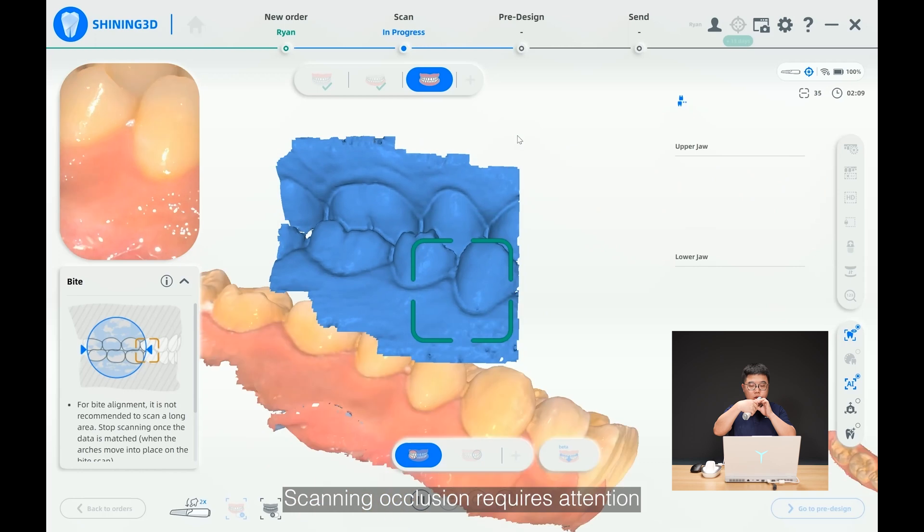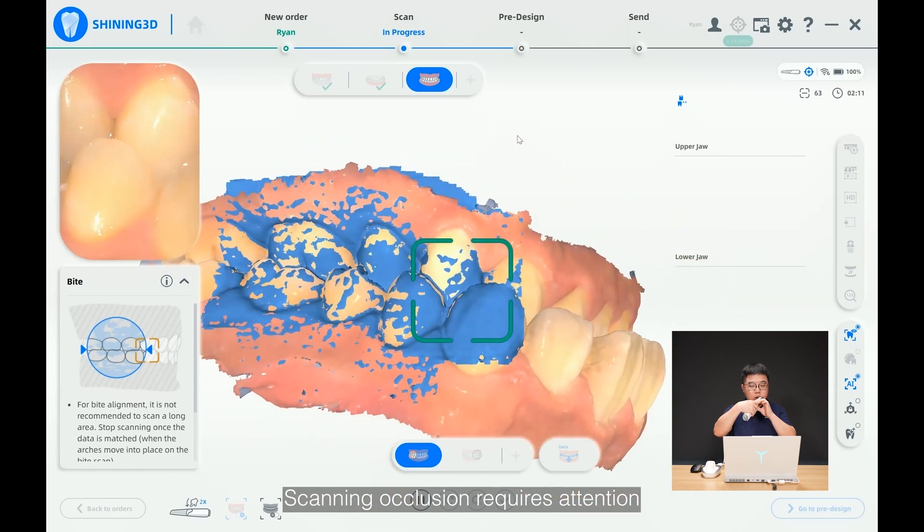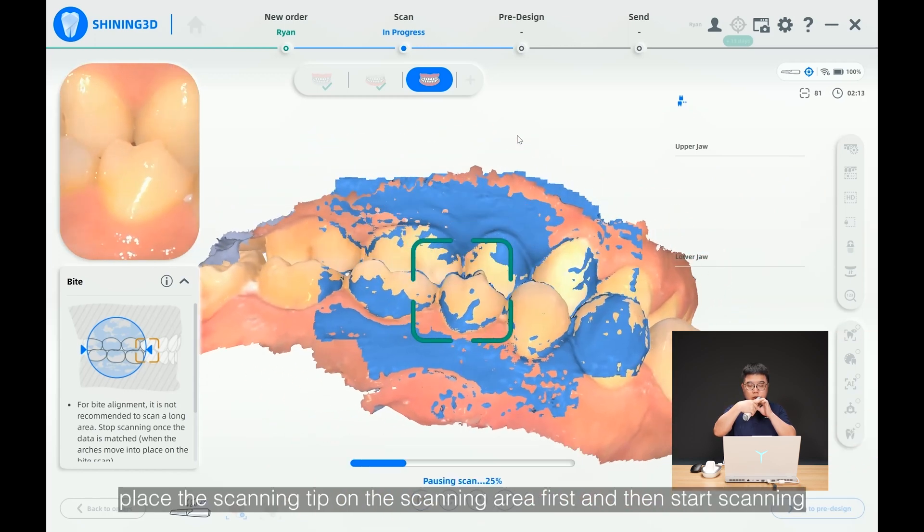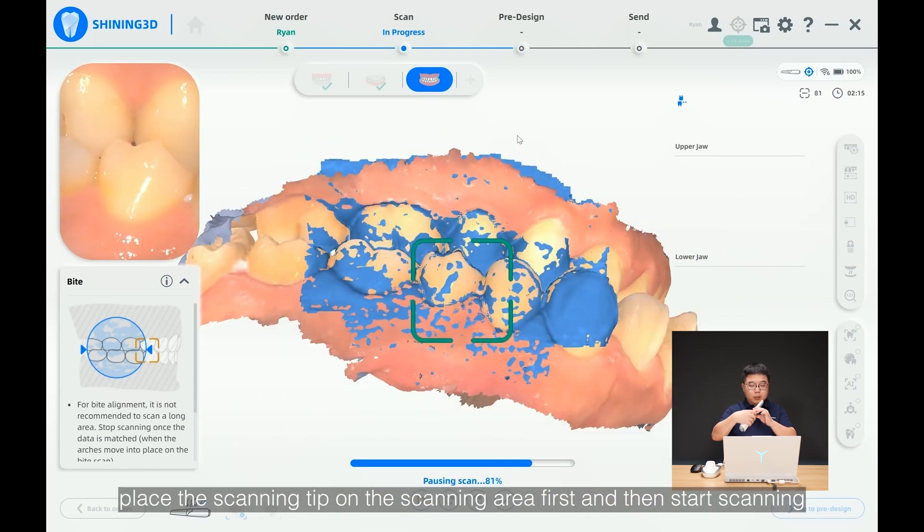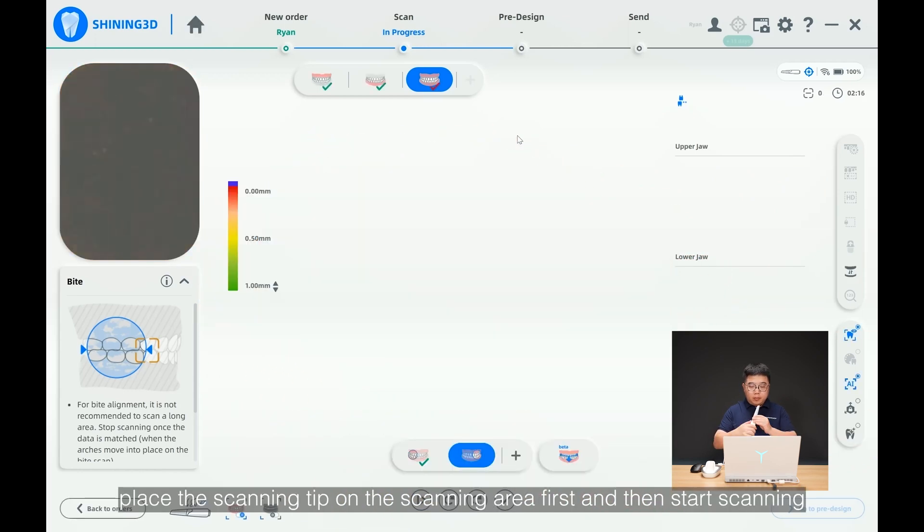Scanning occlusion requires attention. Place the scanning tip on the scanning area first and then start scanning.